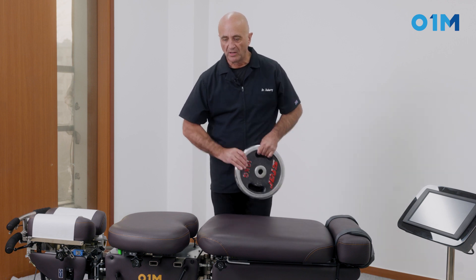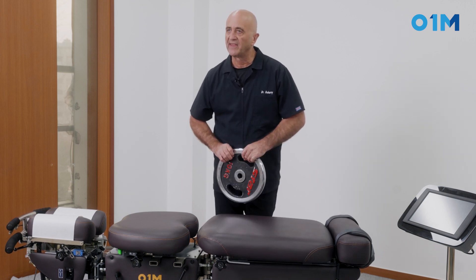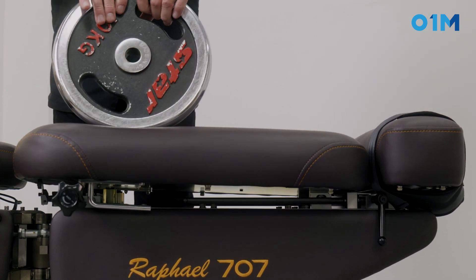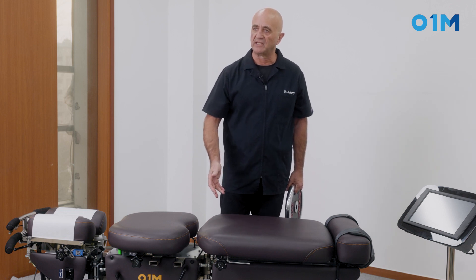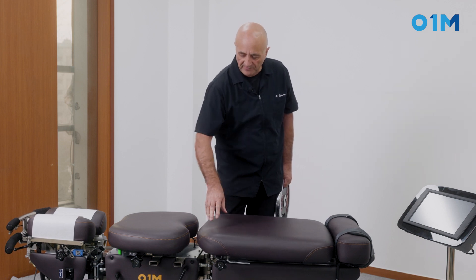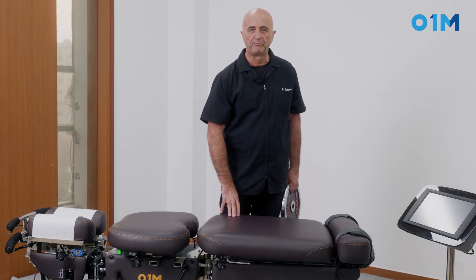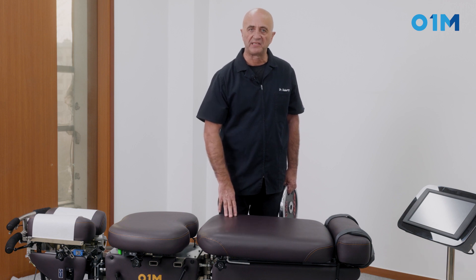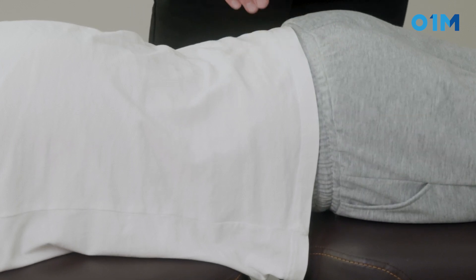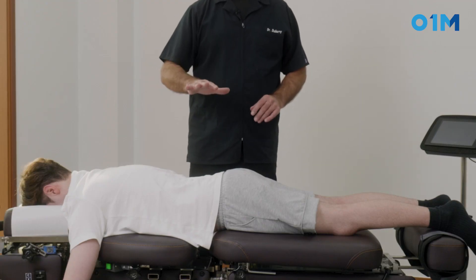To test whether the drop is identical in its tension on the right side, left side, and middle, we use a weight and drop it at different locations. The drop kicks fine here, fine here, fine here, fine here — establishing the sensitivity of the drop across the surface. With this mechanism, you can press any place on the cephalid part of the pelvic piece and get the same intensity of drop.